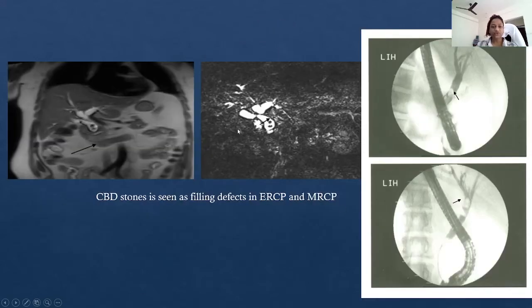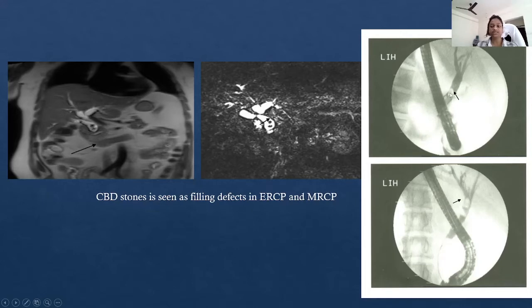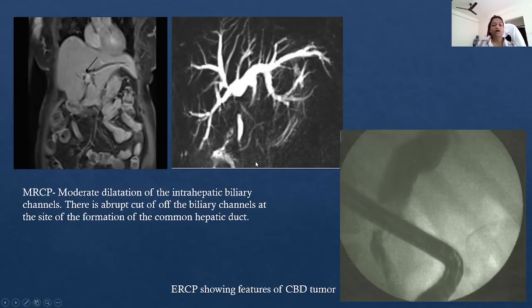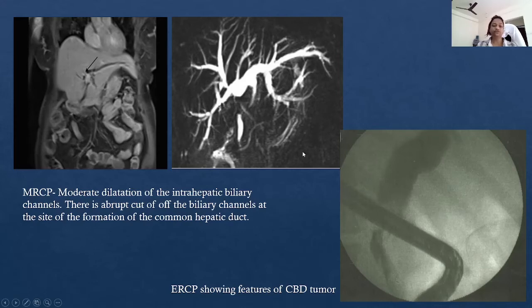Coming to the pathologies: these are coronal MRCP images showing filling defects within the common bile duct, which are CBD stones. These are confirmed on ERCP as filling defects within the CBD. Here we can see a CBD stricture shown as narrowing of the duct, confirmed on ERCP. Another image shows moderate dilatation of the intrahepatic biliary radicals with abrupt cutoff of the biliary channels at the site of formation of the common hepatic duct — features of a CBD tumor on both MRCP and ERCP.